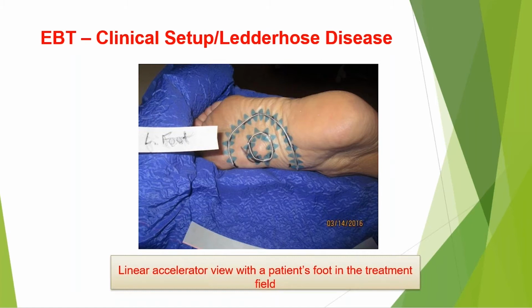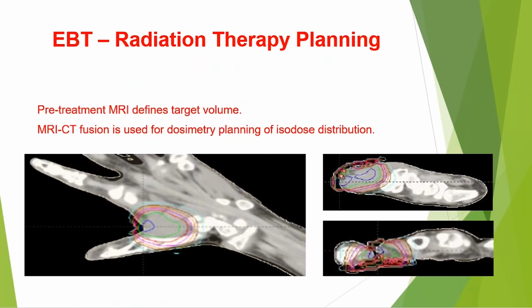We then will fuse with our CT imaging the MR that we've done pre-treatment on the patient, and then also with the radiopaque delineation of the fibroma or nodules and the normal tissue margin, come up with a reasonable plan that involved typically 6 to 9 MeV with appropriate bolus that we would place at the time of CT simulation, which was predominantly 5 millimeters.